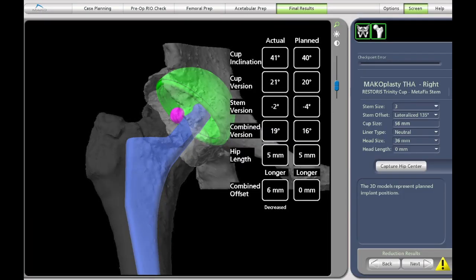At long last, we can check the orientation of the cup, the length of the leg, the offset of the leg, and the femoral anteversion, and confirm that we have reproduced the native anatomy of the hip joint in all of these parameters very accurately.